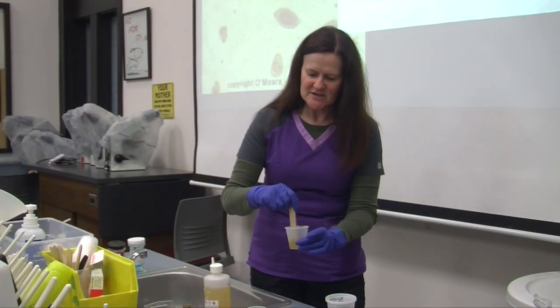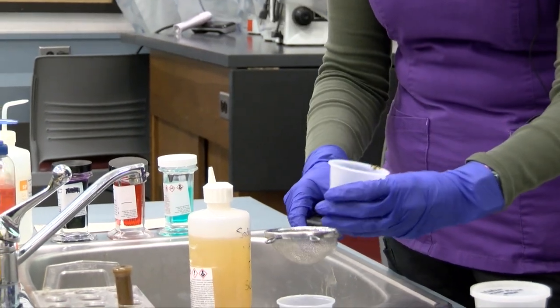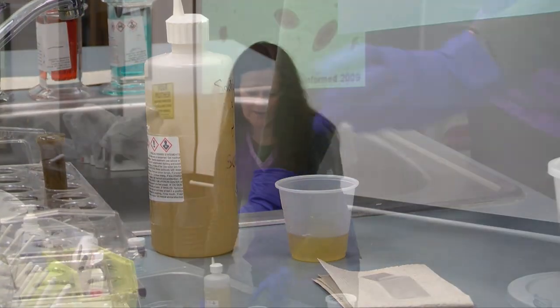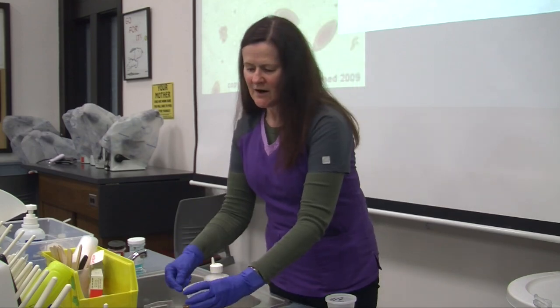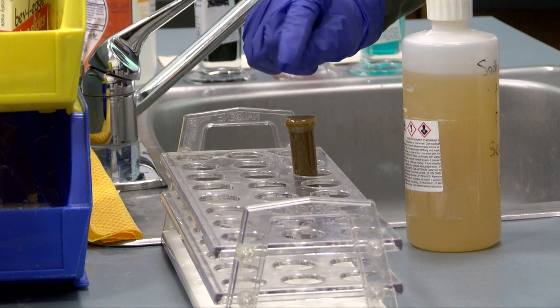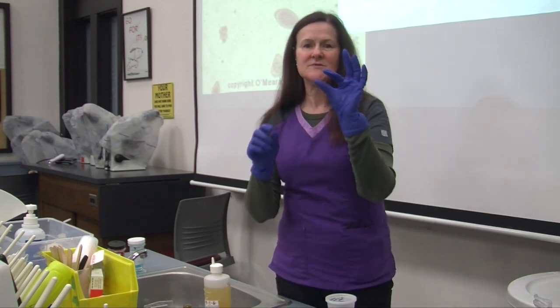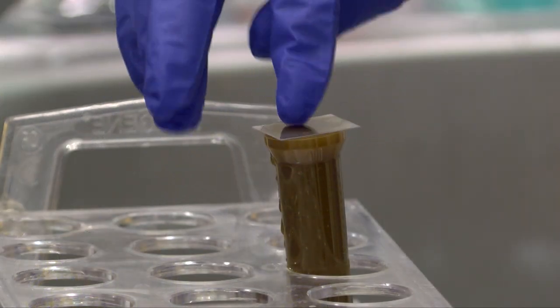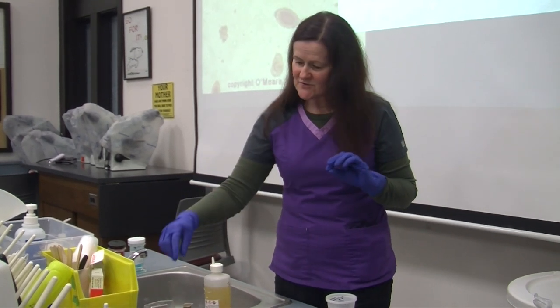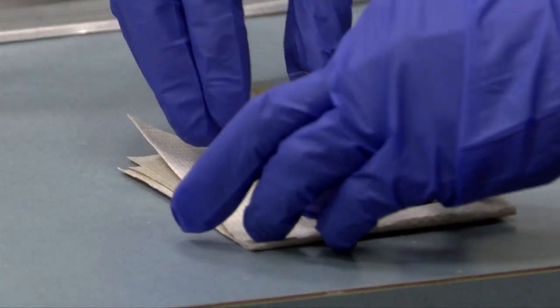We take our tongue depressor and mix it up well. After mixing, we strain the fecal material into another cup and throw the solids away. We then put the solution into a test tube, filling it so that there's just a reverse meniscus — meaning the liquid is just slightly above the top of the test tube. Then we take our cover slip, which is a small piece of clear plastic, and place it on top of the test tube. We wait about 15 minutes; that gives the ova time to float to the top and attach to the cover slip. After 15 minutes we take the cover slip off and place it on a slide.